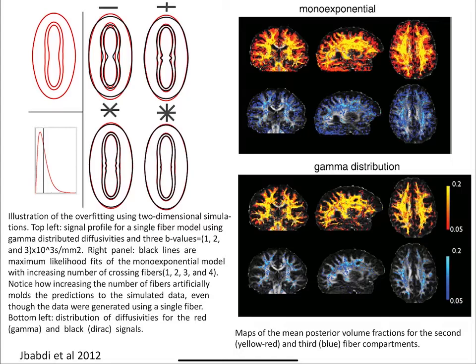And so just to give you a sense of what that means, this is what the MR signal looks like for different b values as I'm increasing the b value, showing what we've seen before, that peanut showing up. The problem is because they're modeling a distribution of diffusion values, it turns out that even though this is a single fiber, this is, I think, 1, 2, 3, and 4 fiber fits. The data is actually fairly well fit by 3 fibers, possibly even better fit by 4 fibers.